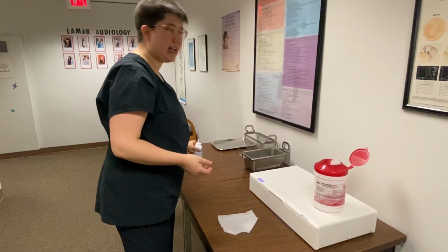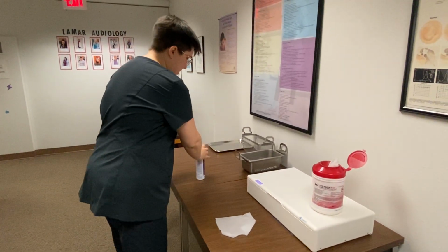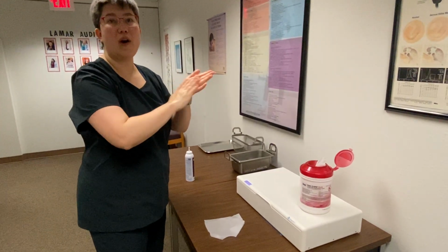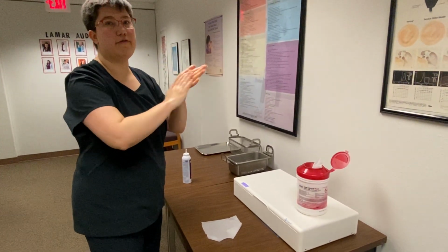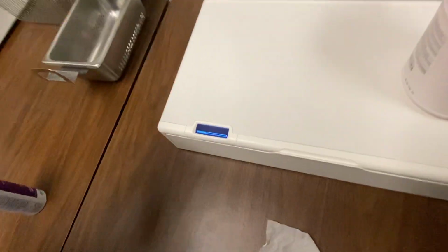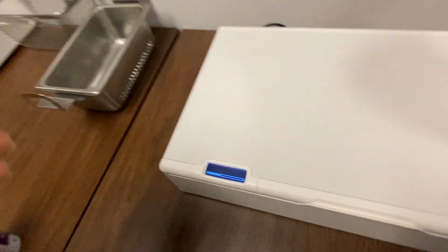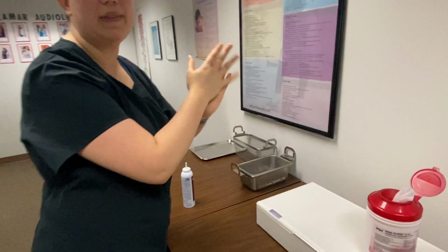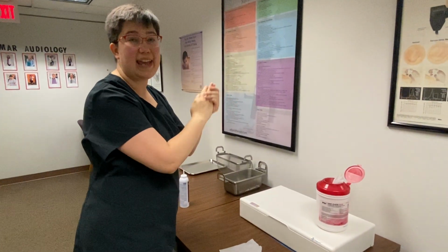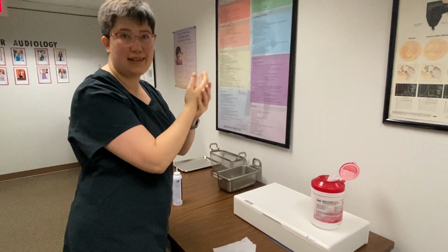And it has a quick clean, and if you need something fast, I guess you could wait for it and pull it open, but we want the deep cleaning cycle. You want it to go the full time. So while that is running, and notice I didn't touch my face at all while I was doing any of this, you're gonna hand sanitize because you just spent that whole time touching a contaminated mask. So you wipe, wipe, wipe, and the hand sanitizing hand wash should go on for about as long as the cleaning cycle.